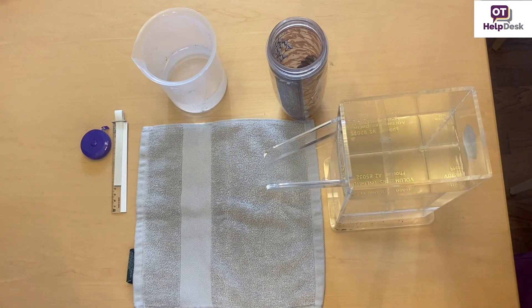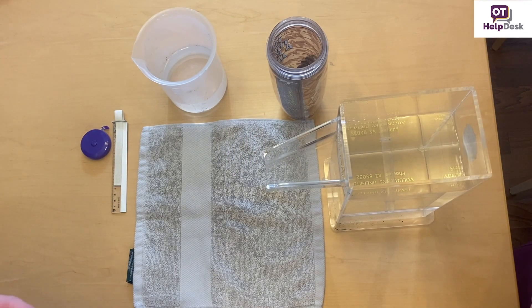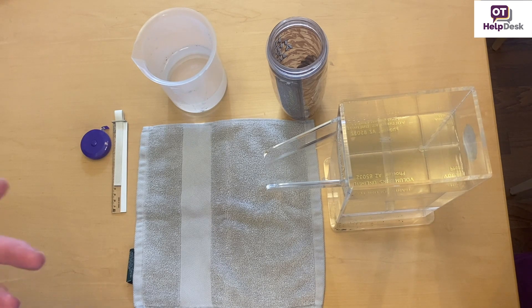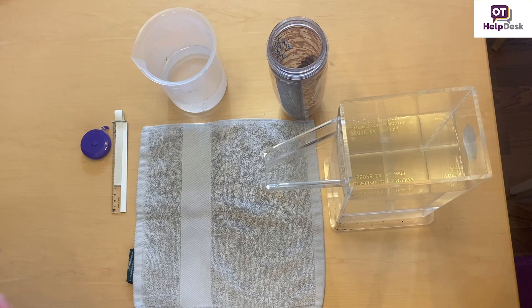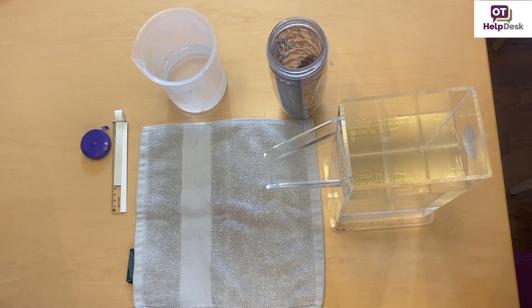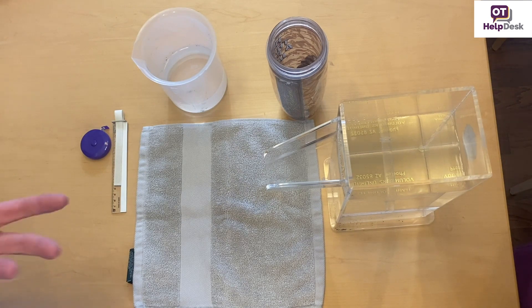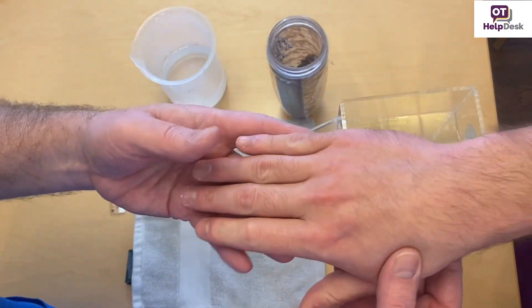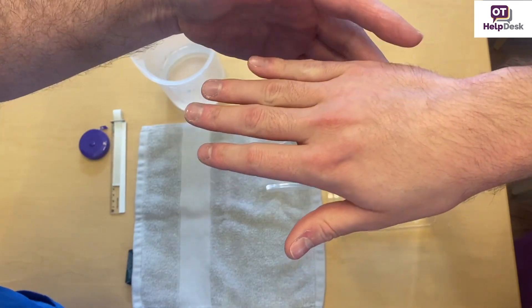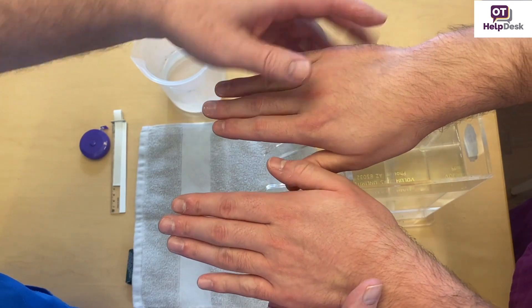So we're going to do edema measures because it's really important in outpatient, and it's one of the things that we look at almost immediately. We ask for pain and then we do edema. We have three things that we look at. Obviously we can look at a hand and determine if there's swelling. Put both hands up here, Joseph — we would compare both hands, right and left.